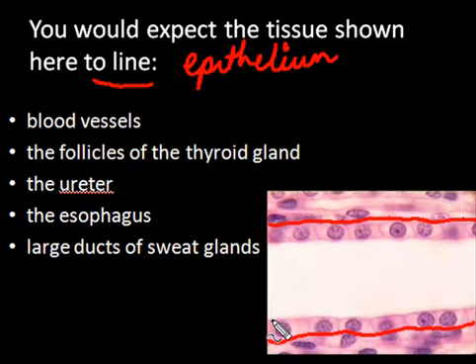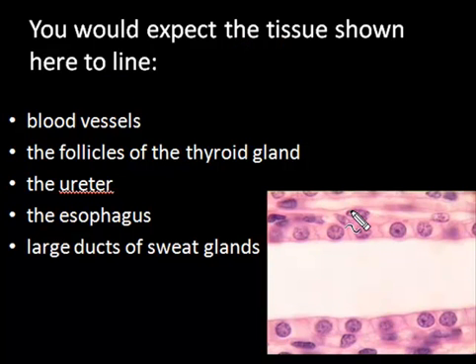So that's the basement membrane, and these are the cells. So if you look at these cells, you can see that they are as tall as they are broad. Hence, this is cuboidal epithelium. Some students often mistake this as stratified cuboidal. It is not stratified cuboidal because they think that this is the second layer of nuclei up here. But if you look, there is no basement membrane. There's space here. The basement membrane very clearly is this one here. You see this one. These are just nuclei of cells present in the connective tissue, as are these. So that's why this is cuboidal epithelium.